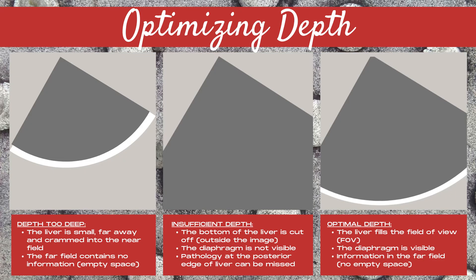So how do you optimize the depth on an ultrasound image? Here are three scenarios using the liver as a guide. In the first image to the far left, the depth is too deep. The liver is small in the image, far away, and crammed up into the near field of the image, and the far field of the image contains no information — this is empty or dead space. When you can help it, you never want to have empty or dead space on your ultrasound image.